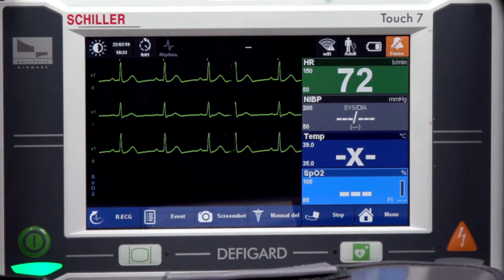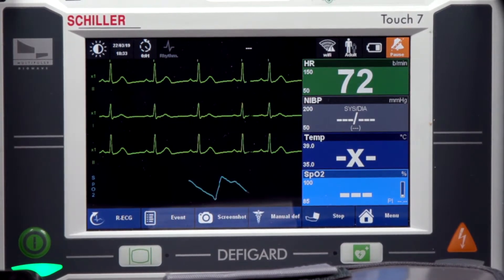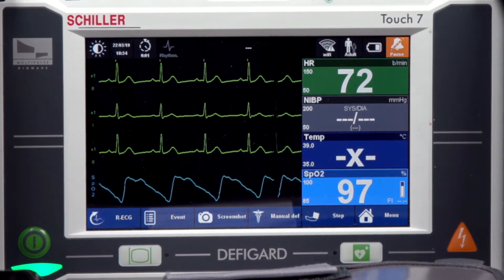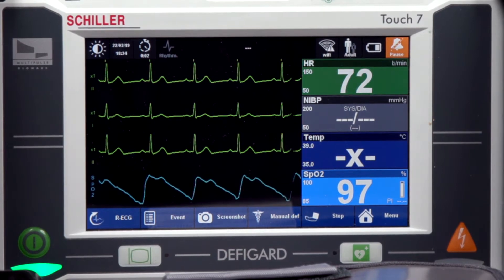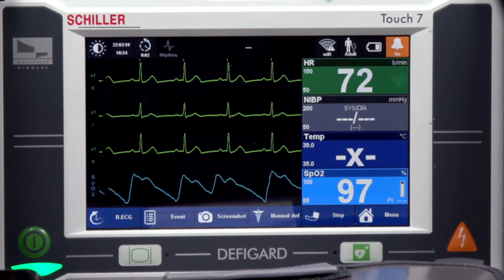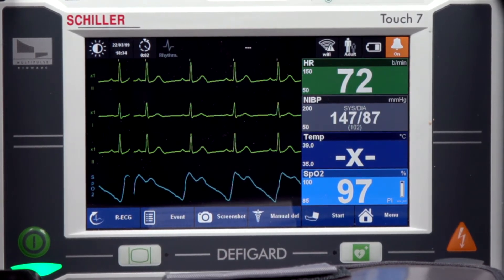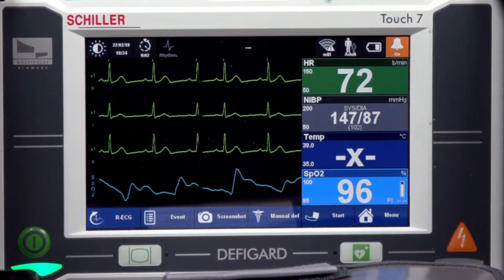I'm going to apply my pulse oximetry probe. So there we have it: three-lead ECG, pleth waveform, heart rate, non-invasive blood pressure, and pulse oximetry.